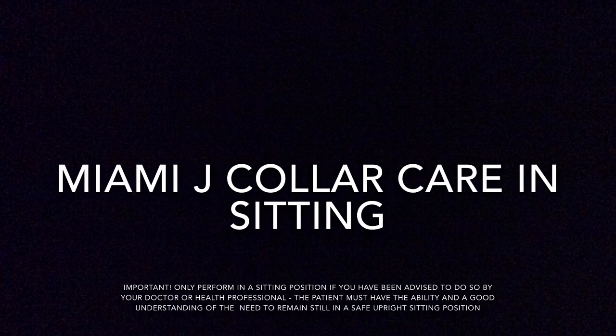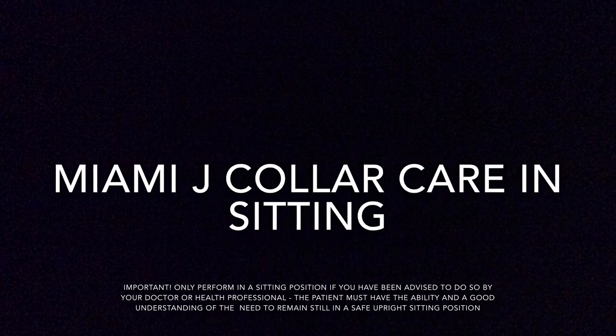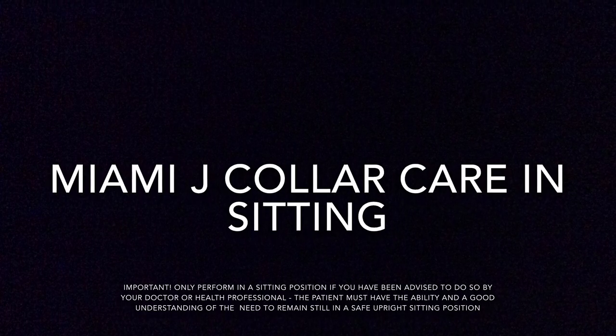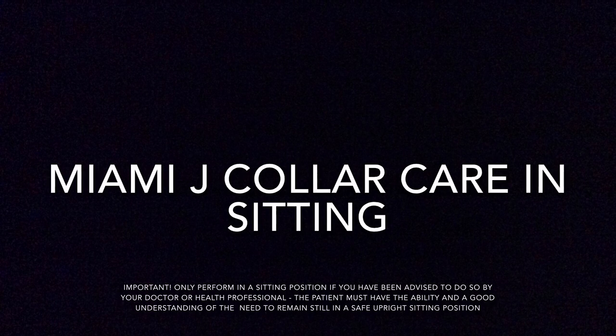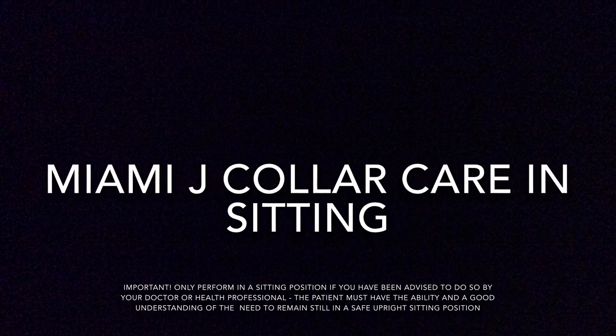It's also important to remember that this must only be performed in a sitting position if you have been advised to do so by your doctor or health professional. The patient must also have the ability and a good understanding of the need to remain still in a safe upright sitting position.